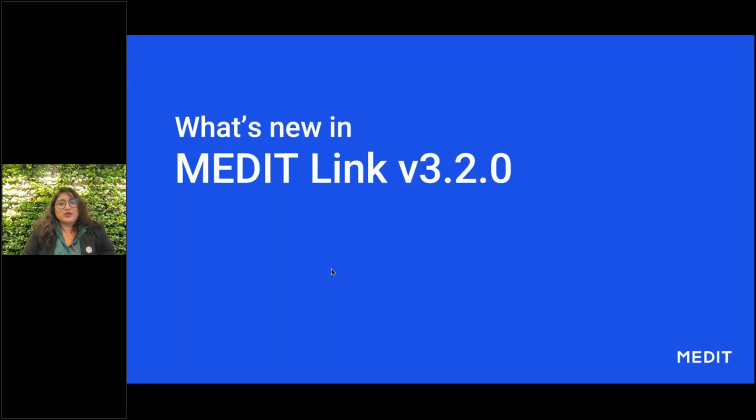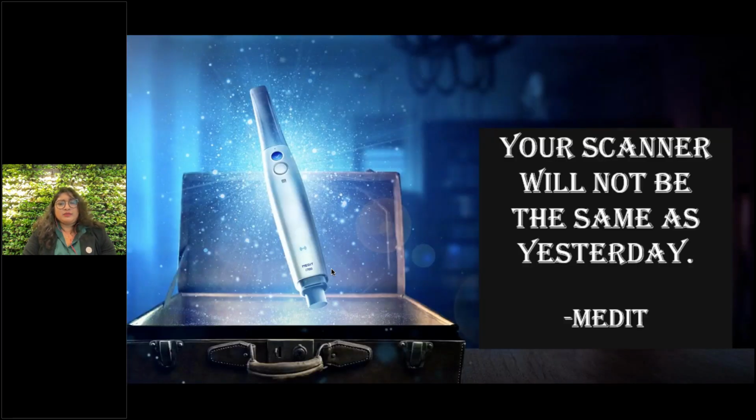Now it's time to address what we have all gathered here for. Today we'll be covering the new updates and changes in the new Medit Link version 3.2, which was released on 7th December 2023. I'll be going over the main improvements and new features. I may not be able to cover all of it due to time constraints, but all of them reflect Medit's continuous dedication to improving the workflow for clinics and labs. And you'll experience once again how, with Medit's software updates, your scanner will not be the same as yesterday.